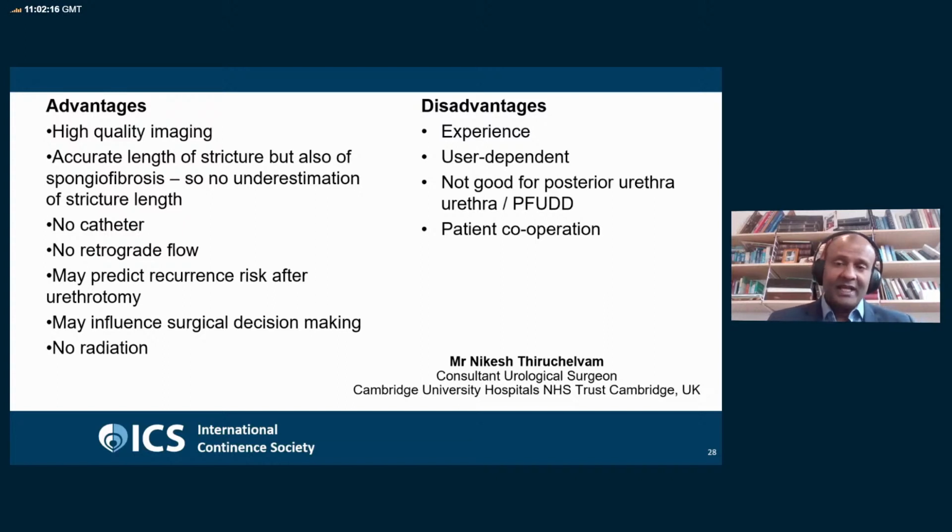Perhaps, and there are inadequate studies in this, but perhaps ultrasound could be used to actually infer which strictures should be operated on by which surgical technique and may predict the recurrence risk after urethrotomy.